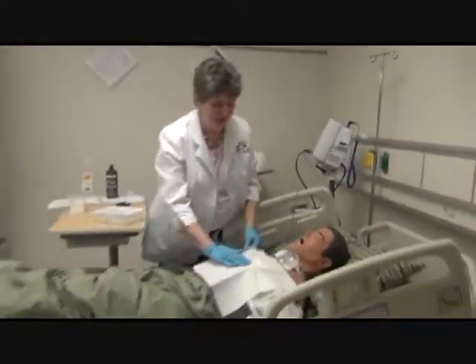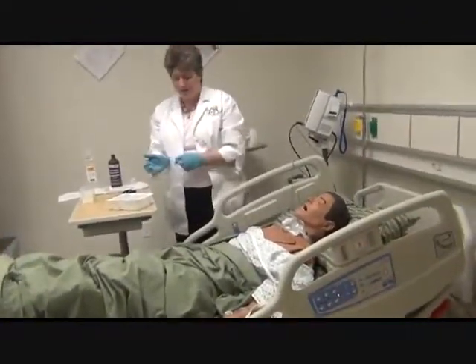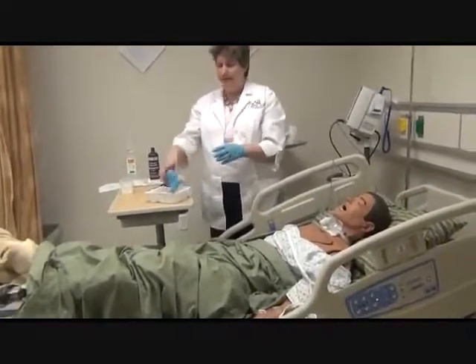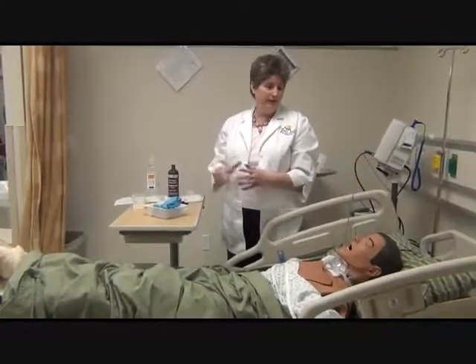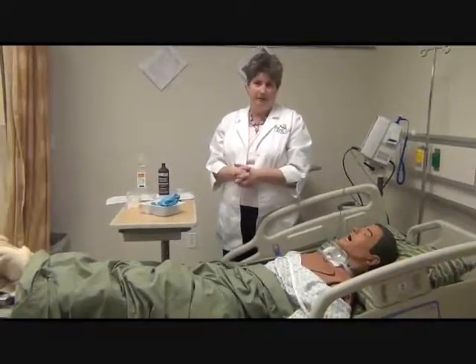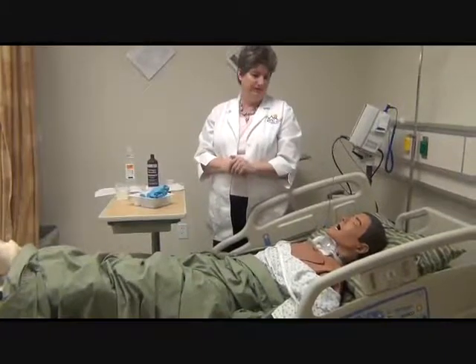We're going to clean up all of our supplies. Always thank your patient, tell them how good they did. This is not a pleasant thing for them to have done. And so you just want to give them reassurance and talk to them. If your patient is not a responsive patient, still talk to them. It's important to give that continual reassurance as you're doing what you do.